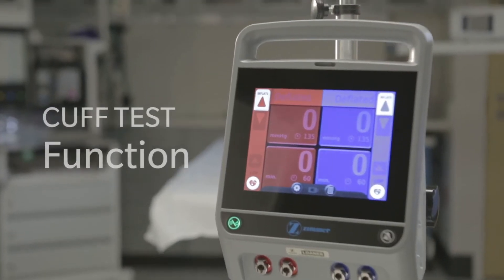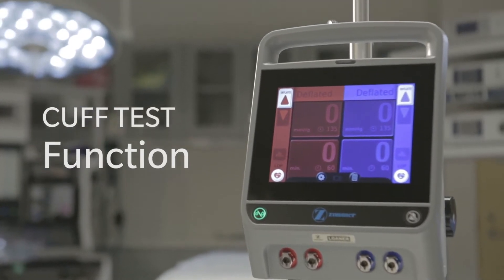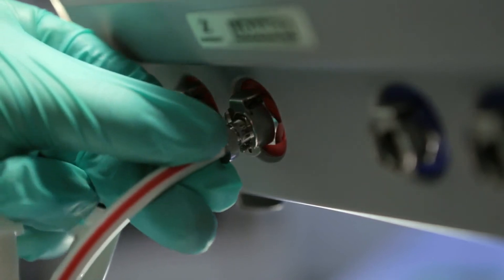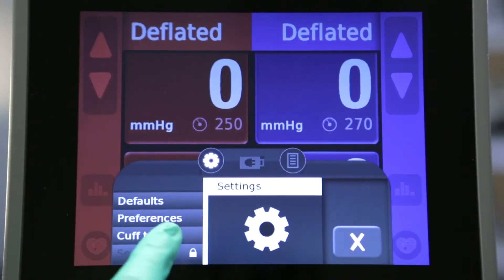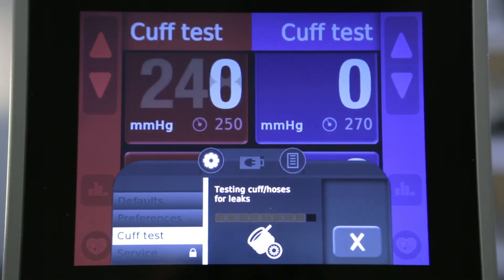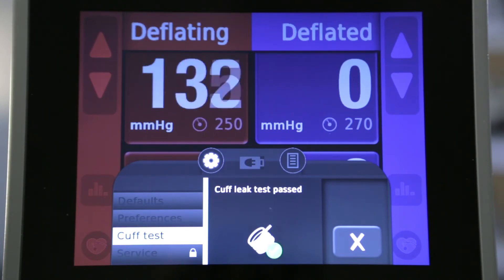The ATS 4000 also includes an exclusive pre-op cuff test function. To test the cuff for leaks, connect the cuff to the main cuff ports, tap the settings icon, then the cuff test menu button. Tap the next button to begin the cuff test. A testing view appears showing an animated progress bar and button. When complete, the display shows pass, leak detected, or error.